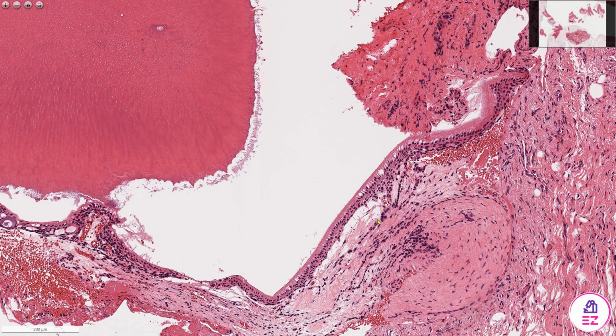If you remember, when we get hard tissue for processing, sometimes we have to put it in acid for the formation of our slides and tissue blocks. And when we put it in acid, any hard tissue is dissolved and washed out. So this enamel space tells me that I must have had mature enamel here, which is usually 98% mineralized, and it's been washed out and dissolved through processing, and we're now left with a space from where it was.